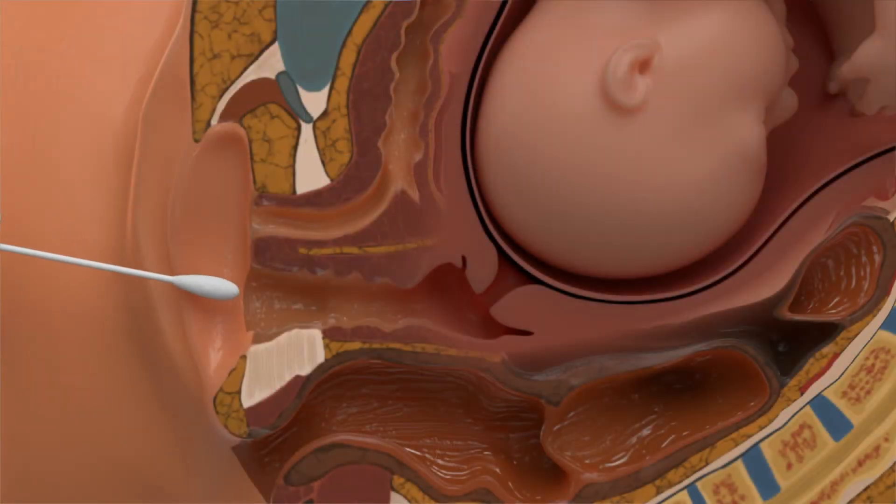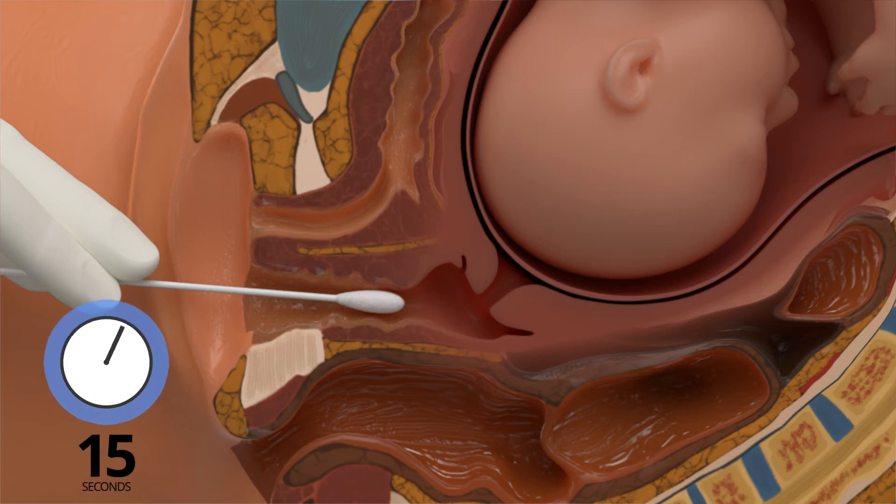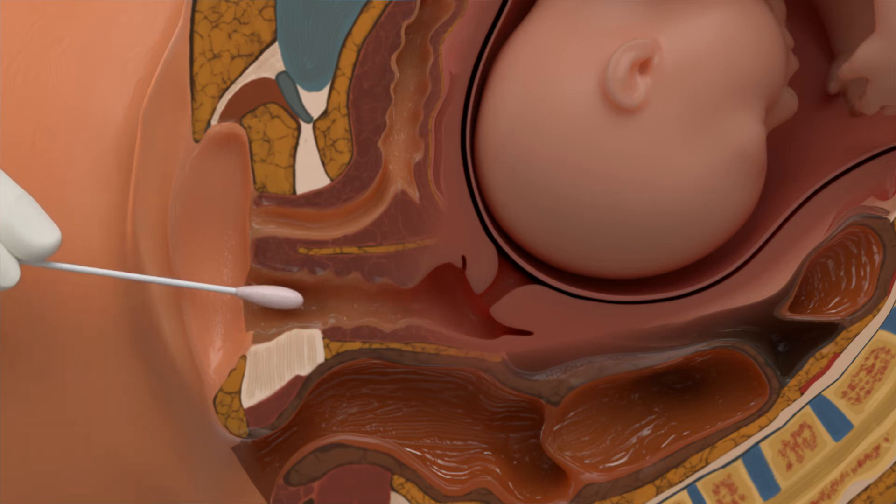Remove and insert the swab tip into the vaginal vault two to three inches or five to seven centimeters. Hold the swab halfway down the stick to ensure proper placement. Collect the specimen and withdraw after 15 seconds.